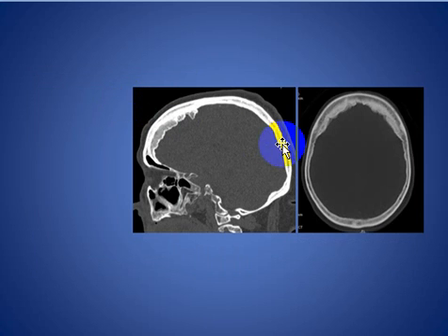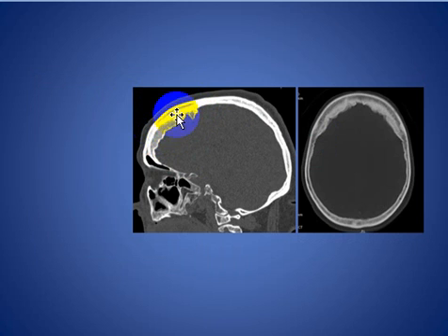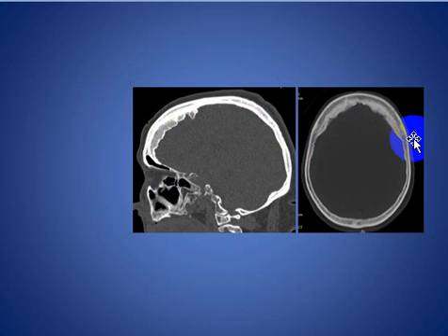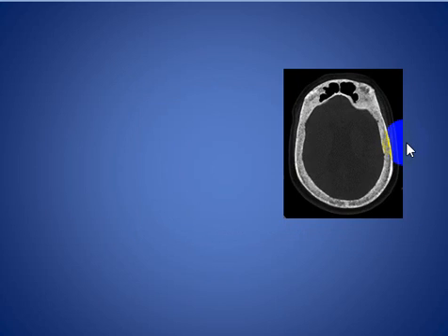Here is another patient with sagittal reformat showing thickening in the frontal region limited by the coronal suture. On the axial cut, it involves the bifrontal region and does not extend beyond the coronal suture.